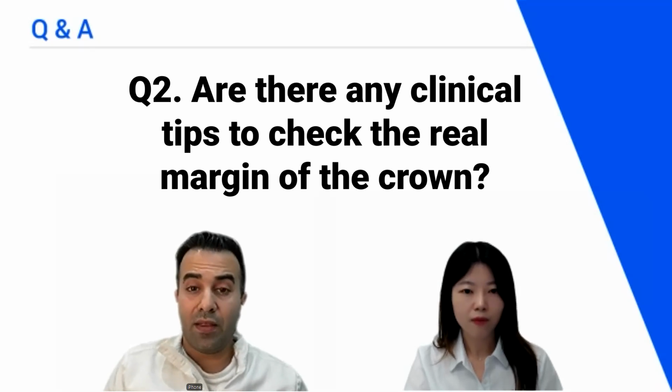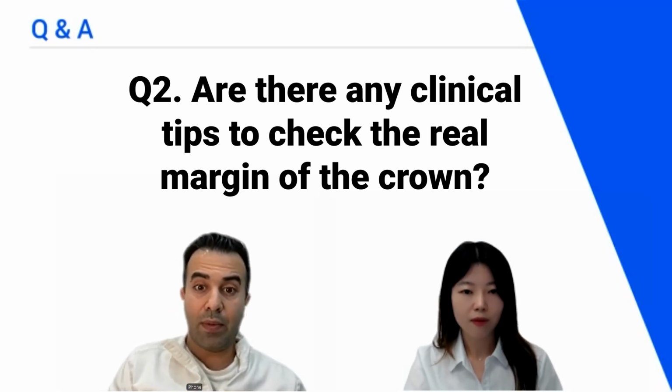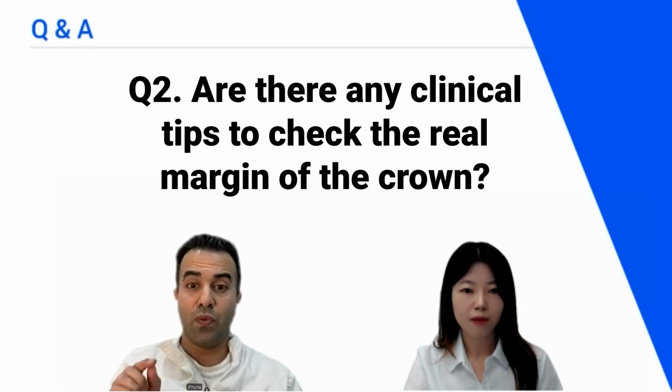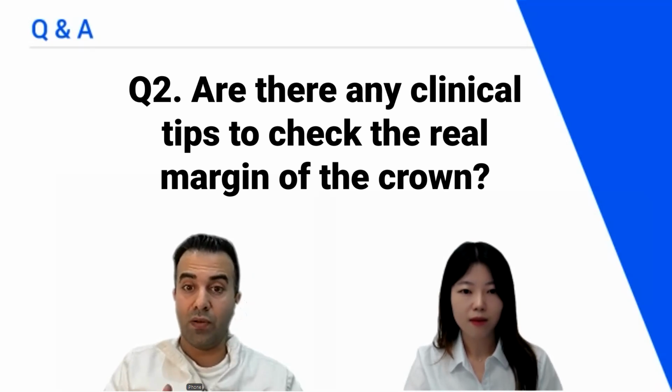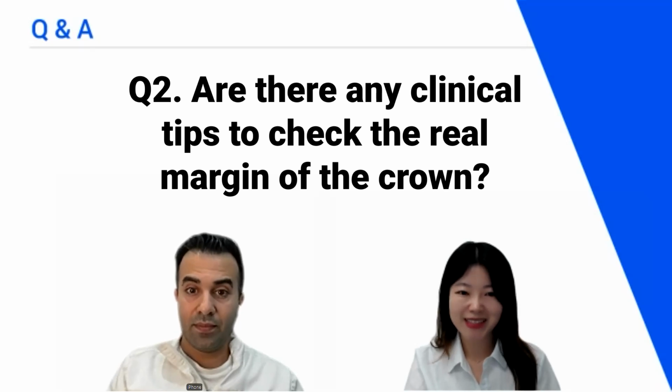And that's the answer. The other tip I would give is, when we export the scan to the lab, I would recommend exporting it in PLY format rather than STL format. We know the PLY is like an STL 3D file, but it has color. The technician can usually switch the color on and off, and they'll use the pink and white to distinguish between tooth and gum. I think that was a real clinical tip for everyone.